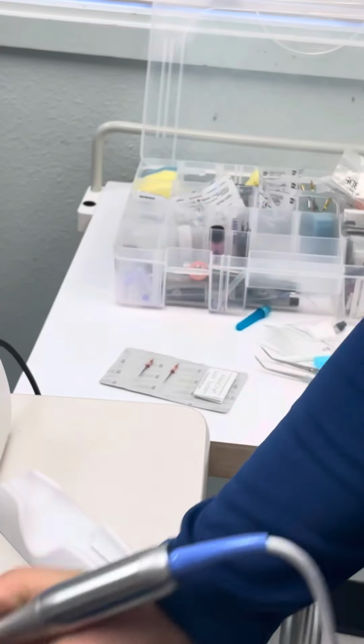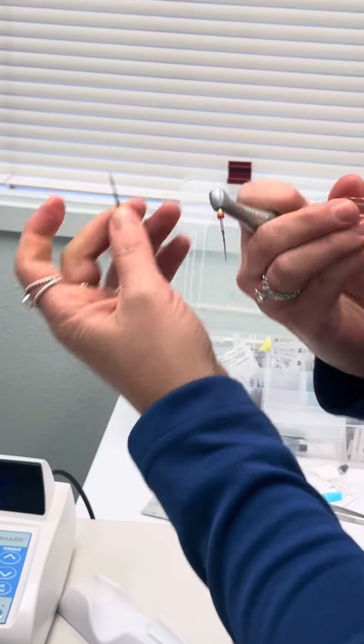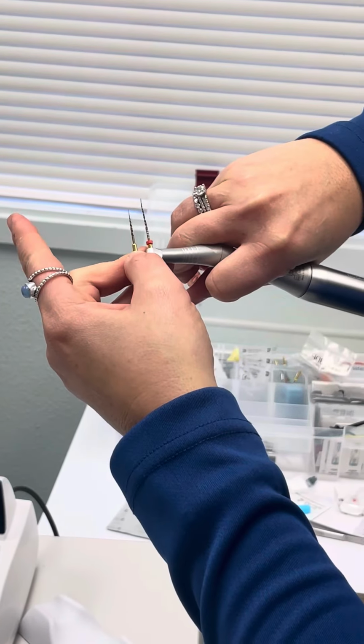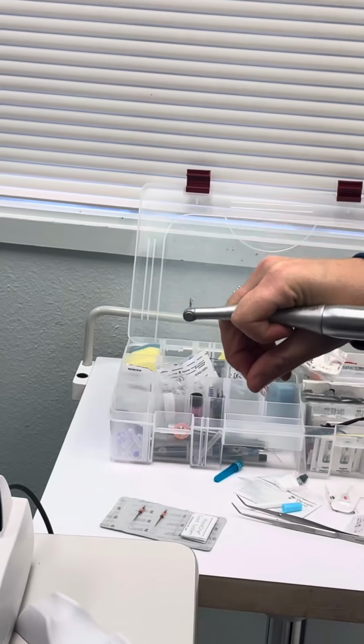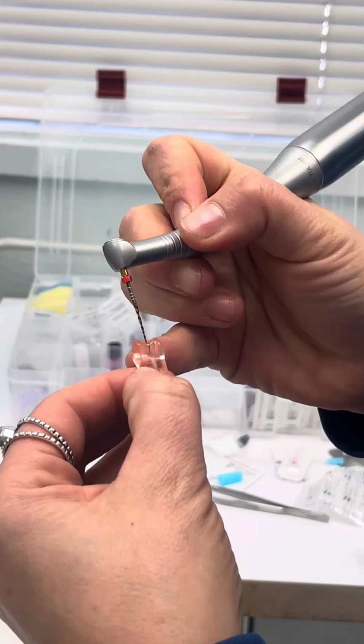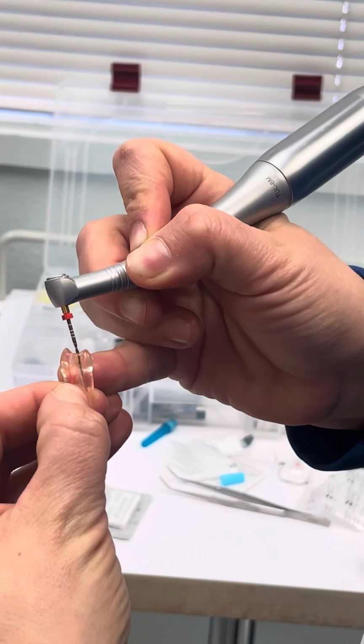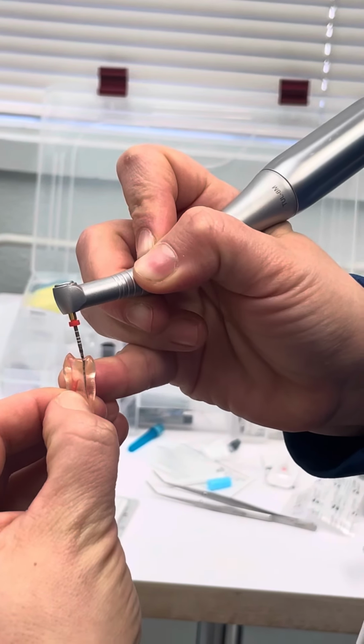And you don't have to worry about this one going too deep because it's actually significantly shorter. It's called an SX19 because it's only 19 millimeters. So now we're going to go ahead and start working our file, and we're going to go away from the furcation.